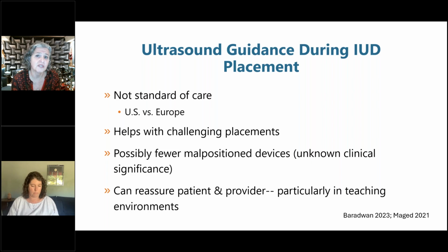But in Europe, for example, many places in Western Europe, they actually use ultrasound pretty routinely. Sometimes they use it instead of sounding. Sometimes they use it instead of using a tenaculum. They'll see that the uterus is really, really axial, and there's no evidence to think that there'd be any problem with the flexion or any kind of little kinks or curves. So it's something that's used differently in Europe. People actually use it instead of a bimanual exam frequently.